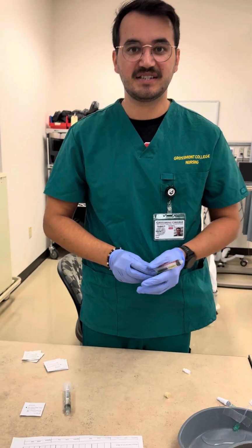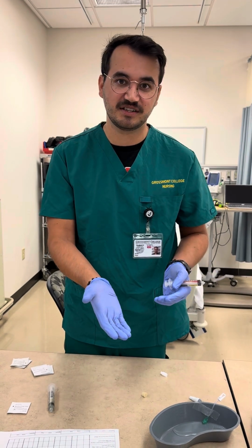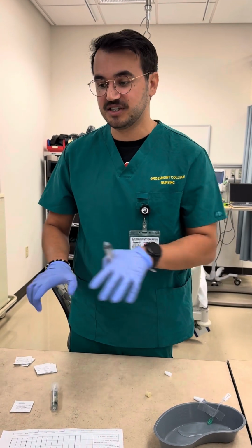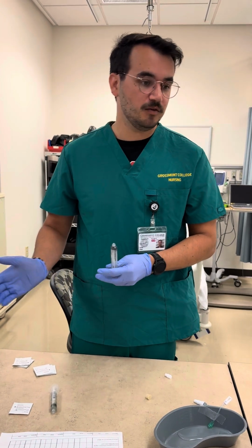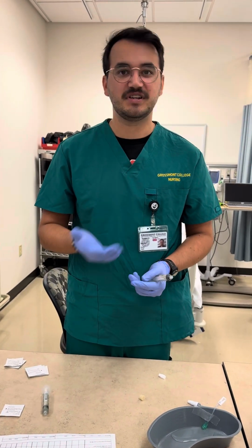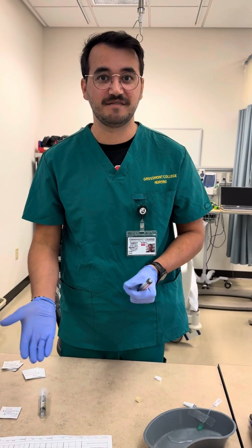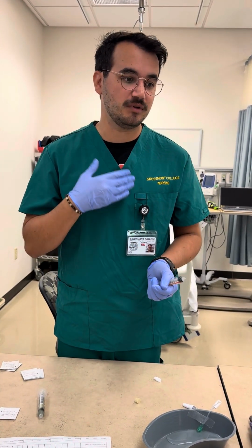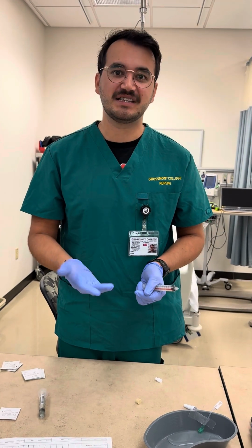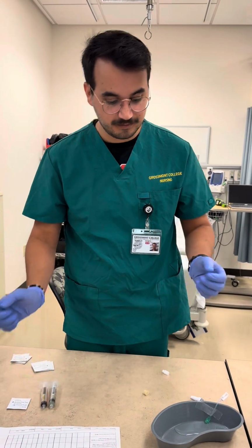I'm going to, at this time, ensure that the patient is aware, once again, and answer any questions and concerns that they have. I'm going to document that I administered the medication, and I'm going to follow up a little bit later, within 15 to 30 minutes, to see how the patient has responded to the medication, if they've had any side effects, and to see if the actual goal of reducing that nausea has in fact occurred. And then I'm all done.